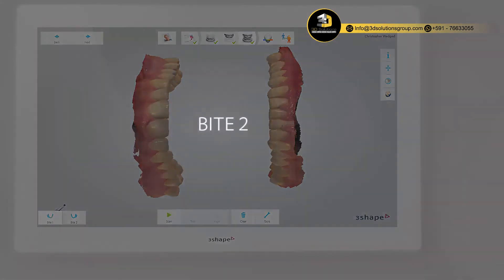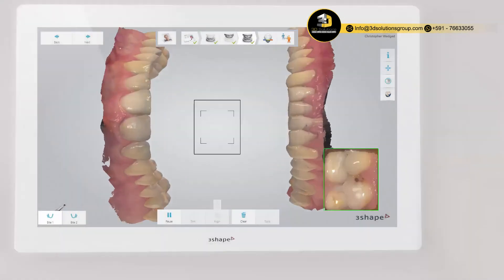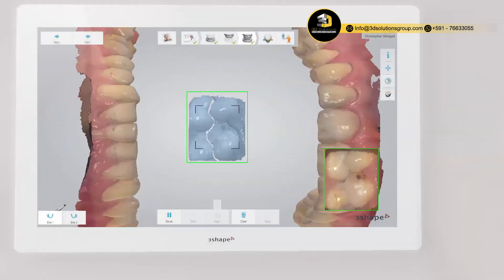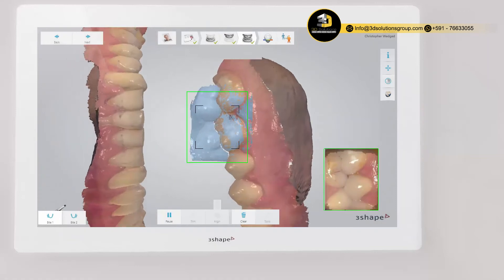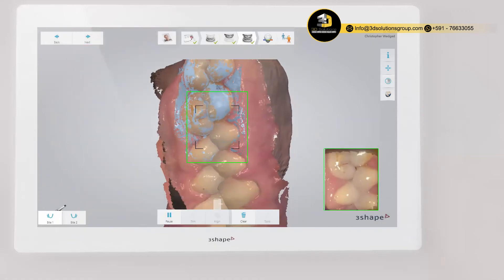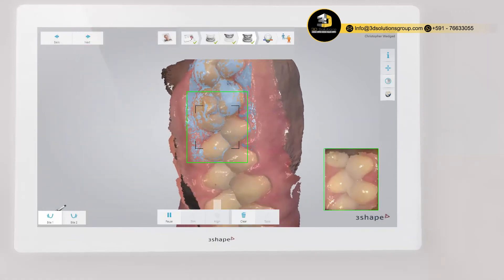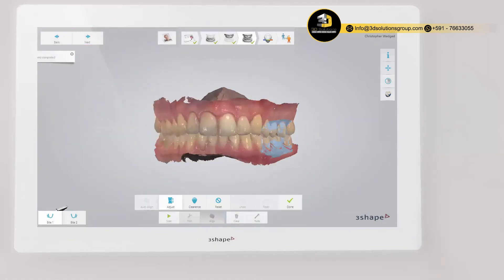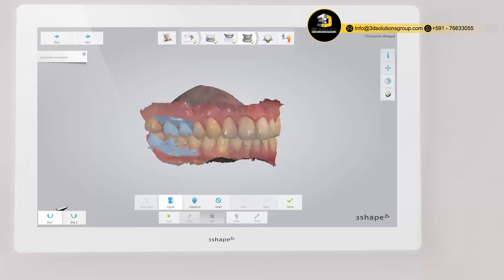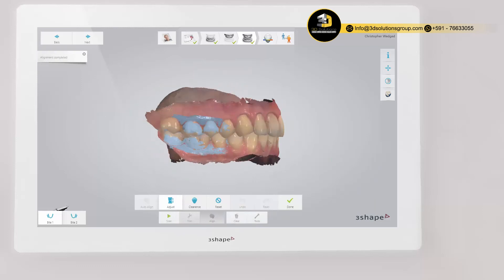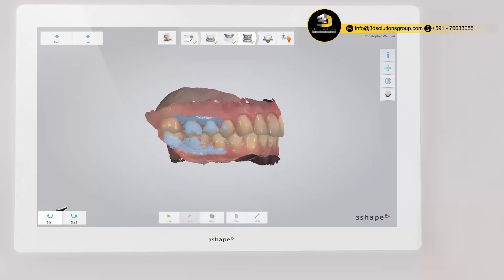Then do the same for the opposite side. When finished, the scans of the upper arch and lower arch are placed in the correct occlusion.